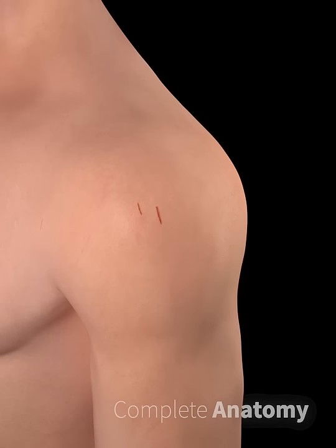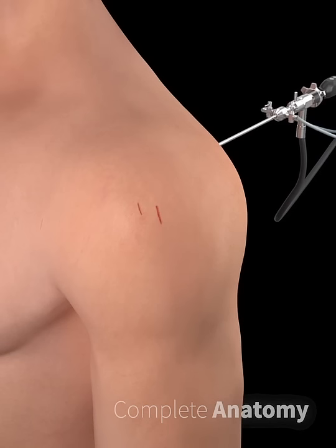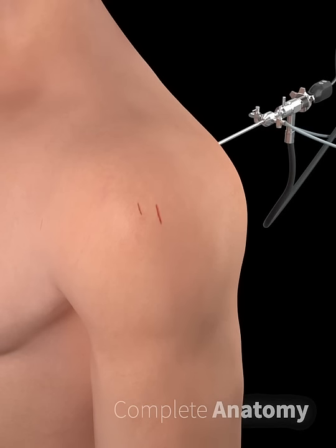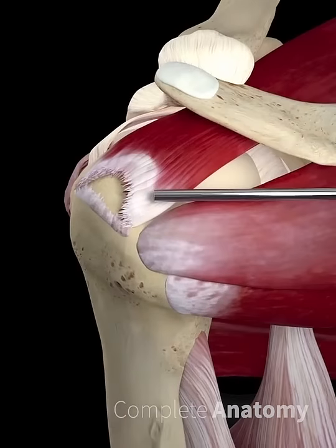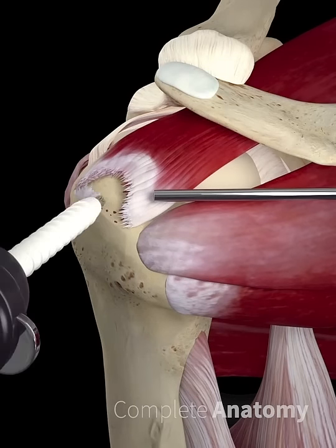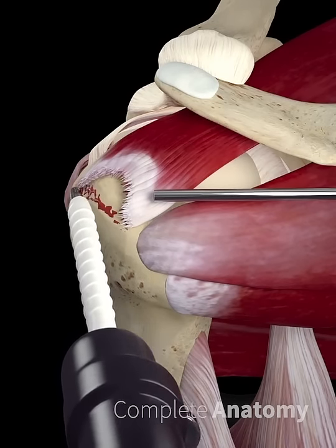Small incisions are made to allow arthroscopic investigation of the damaged region and to allow the instruments to access the region. The damaged tissue surrounding the tear is removed and frayed edges are trimmed and cleared.